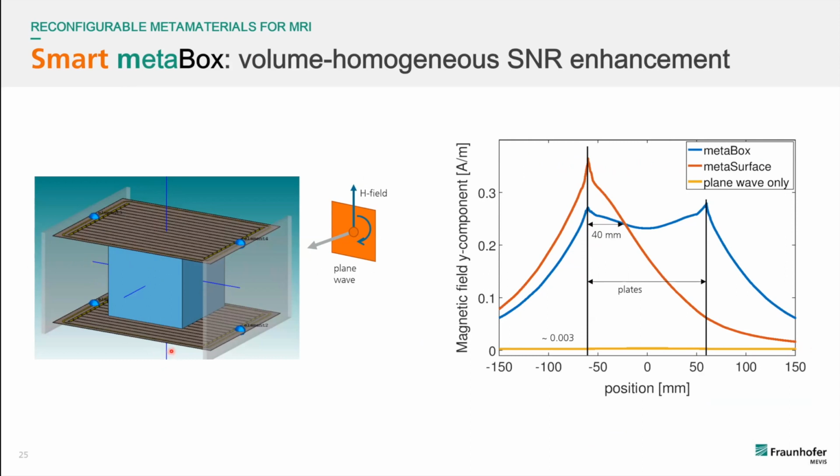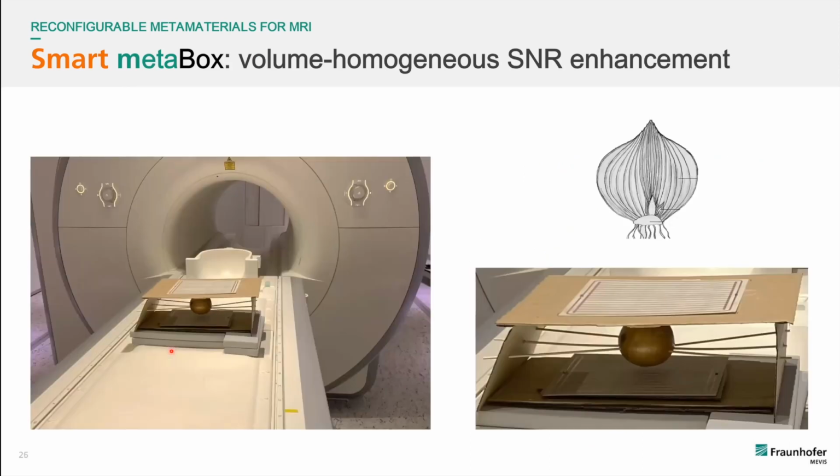And we've proven this with a very professional experimental setup, as you can see here. So again, taking an onion with some shashlik spikes and just having this onion levitating in here, which allowed us to very easily just remove the metamaterial on top anyway, but also on the bottom here, just have it in, have it out.